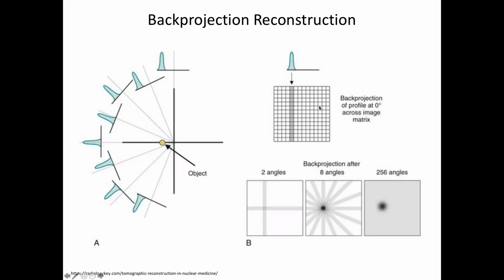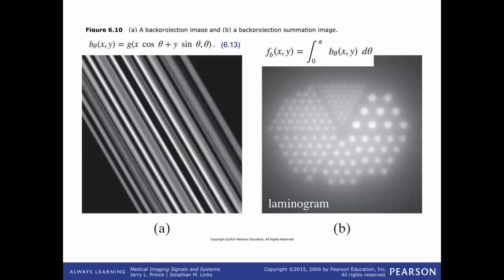That makes sense, because in back projection, if I take the signal and spread it over the entire column, I have non-zero data outside here, and there is no data out there. So that's just wrong. It's an estimate, but it's wrong because I get data in the background. While this is building up, I do see that there's all of this data out here that has positive signal that should not be there. So that's not the correct way to do it.